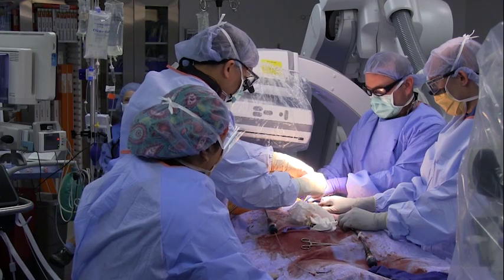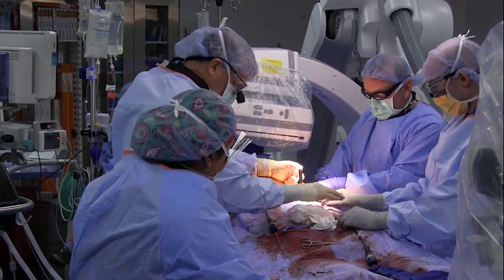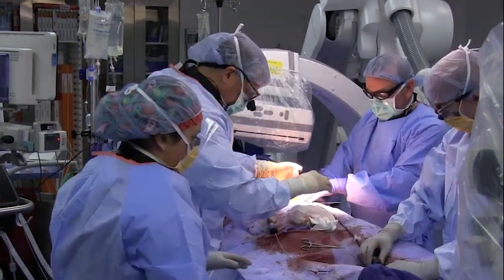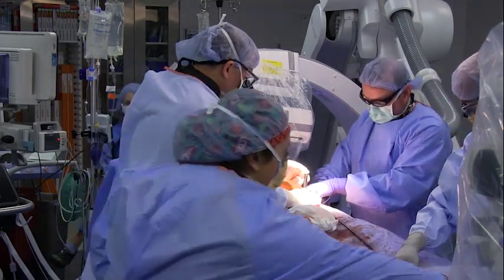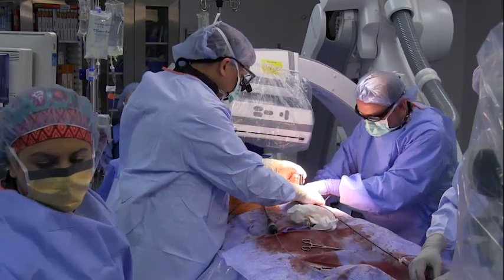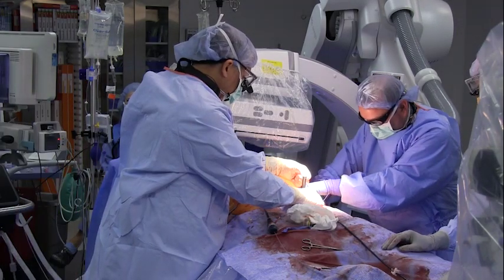Closure. With the wire still in place, remove the sheath. While holding pressure with manual compression, use the knot pusher to cinch down the knots that were placed by the ProGlide devices at the beginning of the procedure.